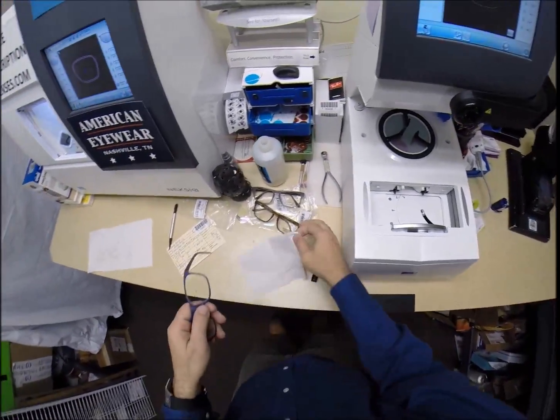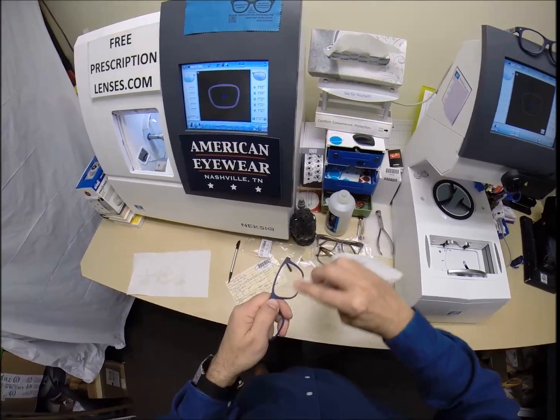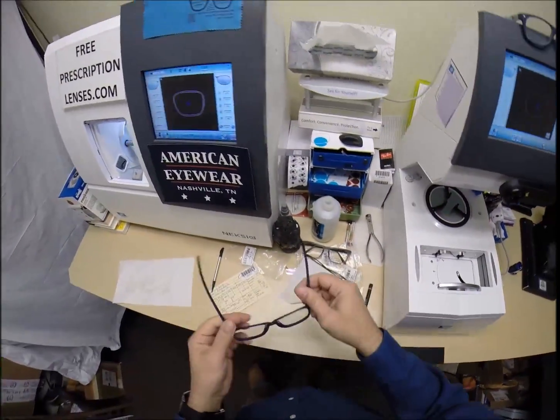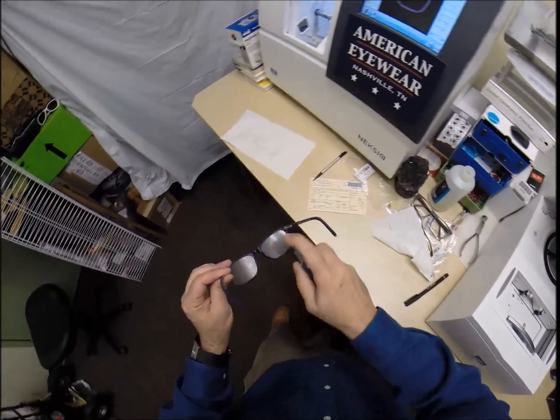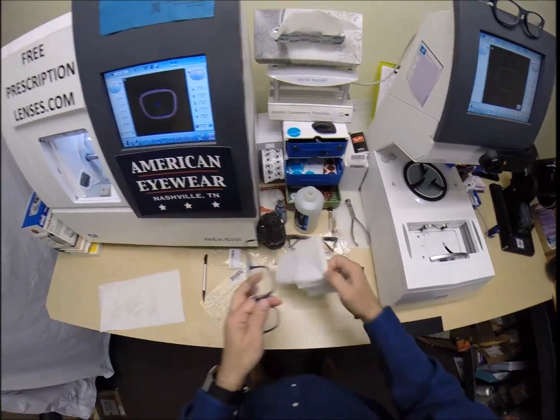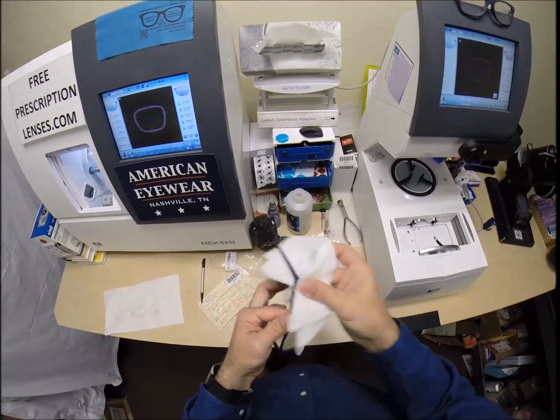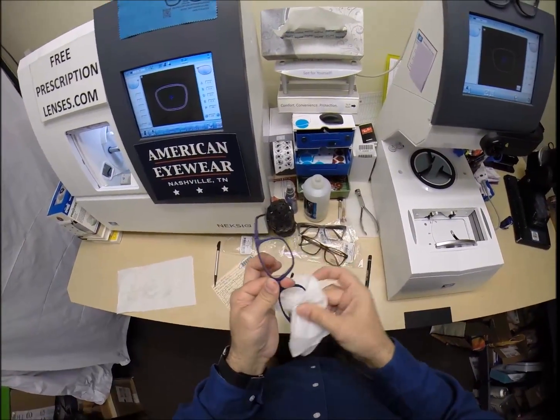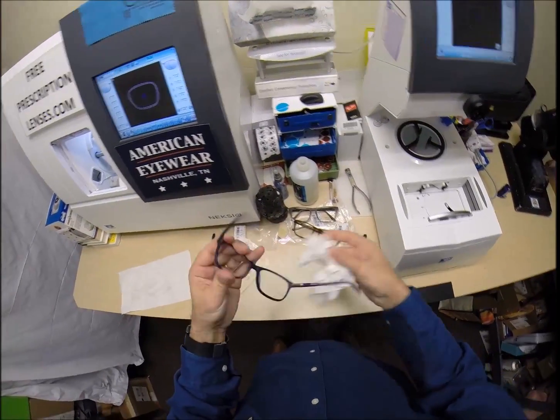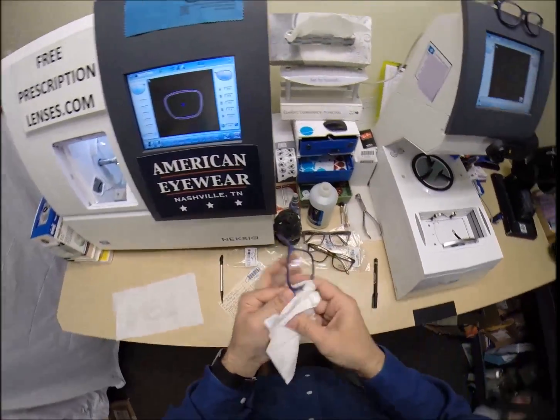Now, if I can clean your lenses off, that I mentioned, when you get these in the mail, there's a small chance that these could fit too loose or too tight. However, there's an 80% chance that one side is going to sit higher than the other. That is because 80% of people have one ear that is higher than the other, and because of that statistic, 99% of all optical shops will do free adjustments if you ask them. Rick is the rare person who I will deliver these to and do the necessary adjustments for him.